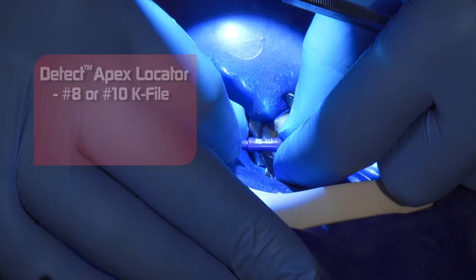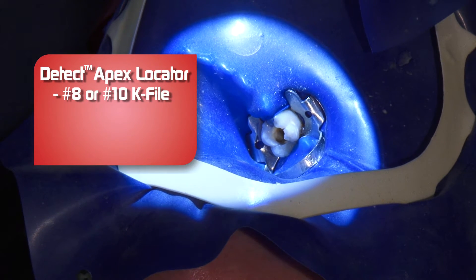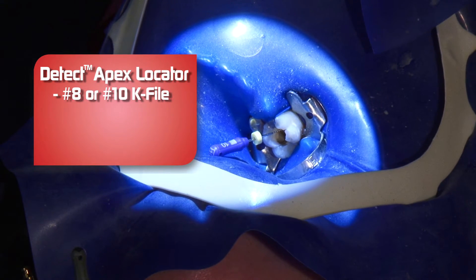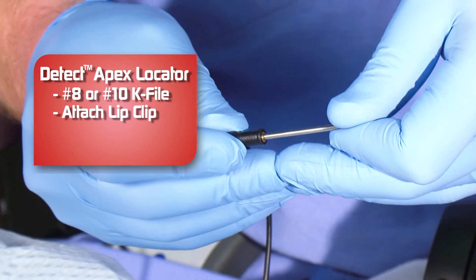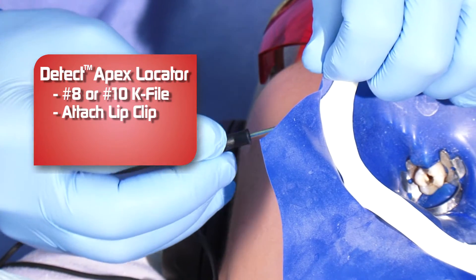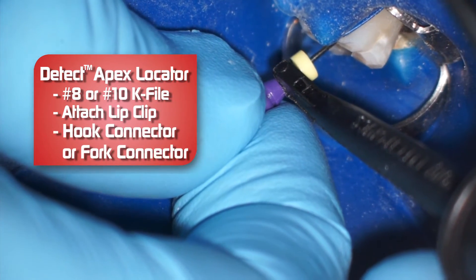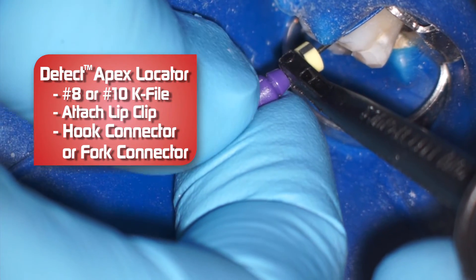When I'm getting my initial length, I start with the number 8 or 10 hand file. Of course I've already made the educated estimate of the working length thanks to the radiograph. I gently work my hand file down the canal. When I get about halfway down, I will get out the DTEC. Connect the lip clip like so. In this case I'm using the hook connector, but in some more difficult to reach cases I'll use the fork connector to make contact with the file.